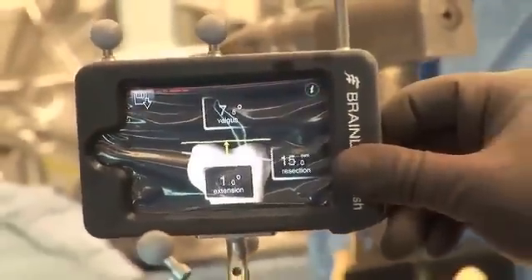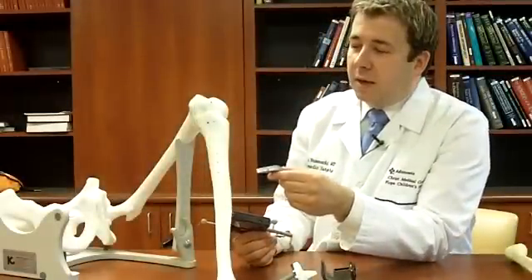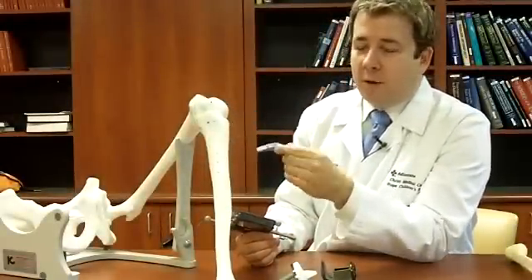As you can see in the TV screen, I'm able to adjust the angle of my cuts to help better position my implant. So now I'm going to demonstrate how the tibia cut would be made and how you would align up the cutting guide as if you were the surgeon.